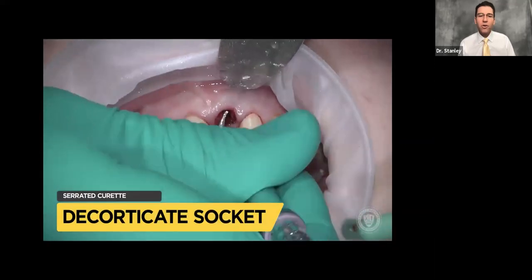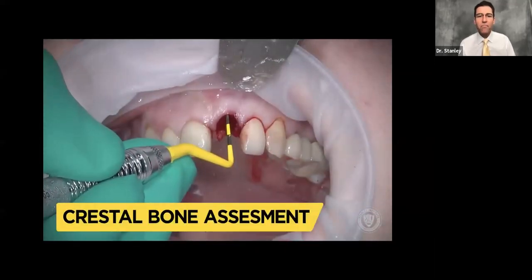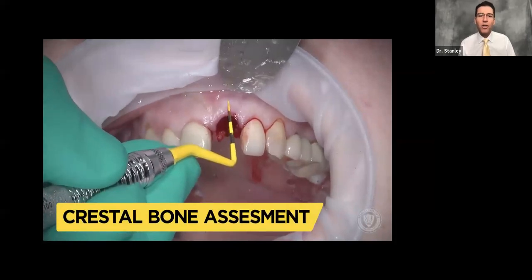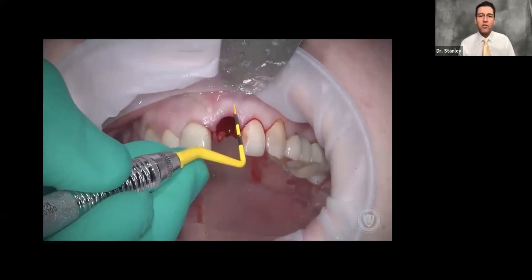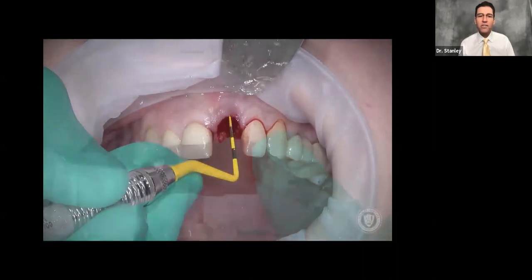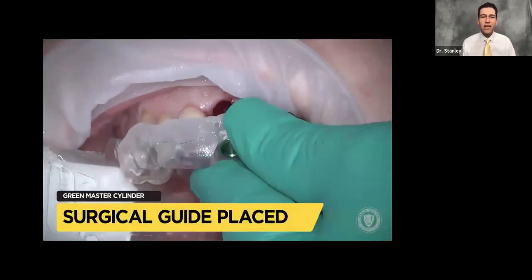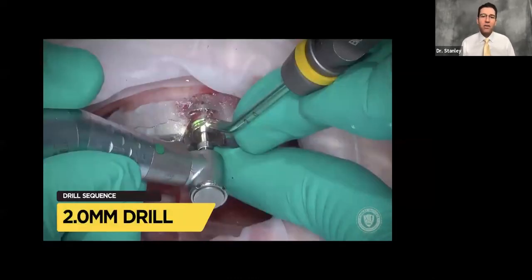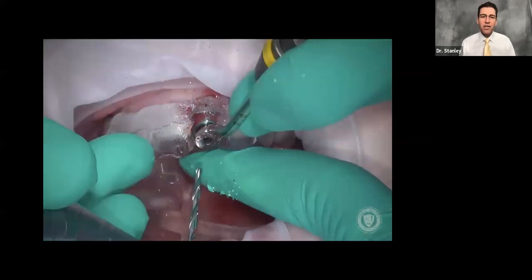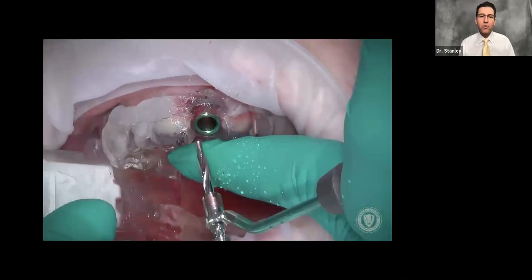We're going to decorticate the socket and clean it out with the curette — this is very important. We're going to measure the buccal bone, and in this case it's three millimeters below the free gingival margin, so it's in an ideal position. The buccal bone is intact. We're going to use a fully guided type four guide.